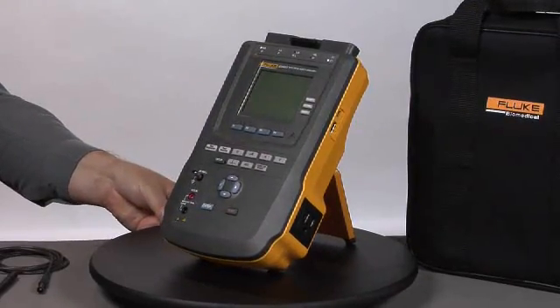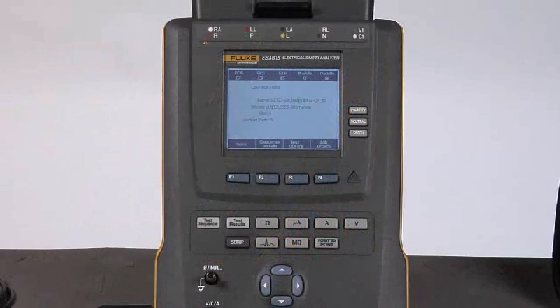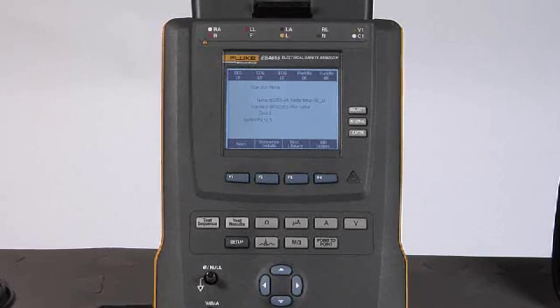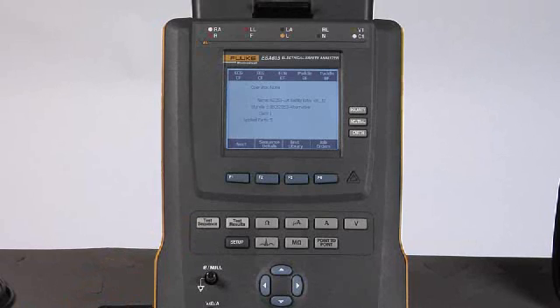Now we're ready to introduce the controls. Let's do a quick overview of the functions and features of the ESA615 Automated Electrical Safety Analyzer. The unit defaults to the last auto sequence that was just completed, so we would otherwise select the auto sequence button to get to the display you see on screen.